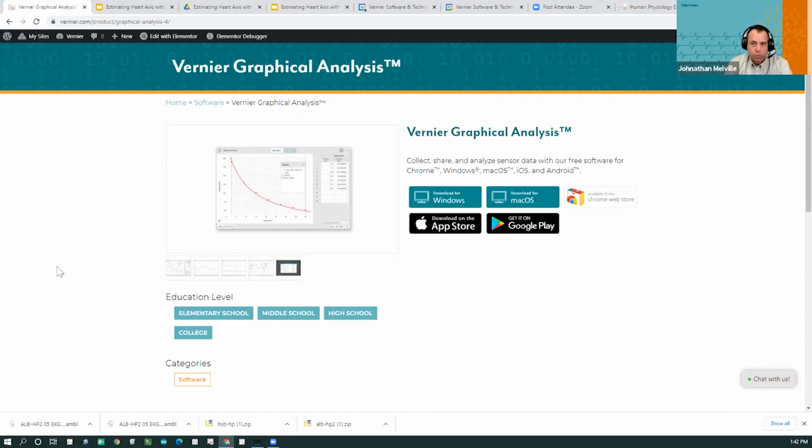There's also some really cool other advanced features that you would want GA Pro to have if you were going to be doing analyzing EMGs. But you don't need anything else. If you get the sensors, the software that you need to use them is free. GA Pro is just a really cool feature that we have that we developed for remote learning. Another thing that you might want to be aware of that I can show you.